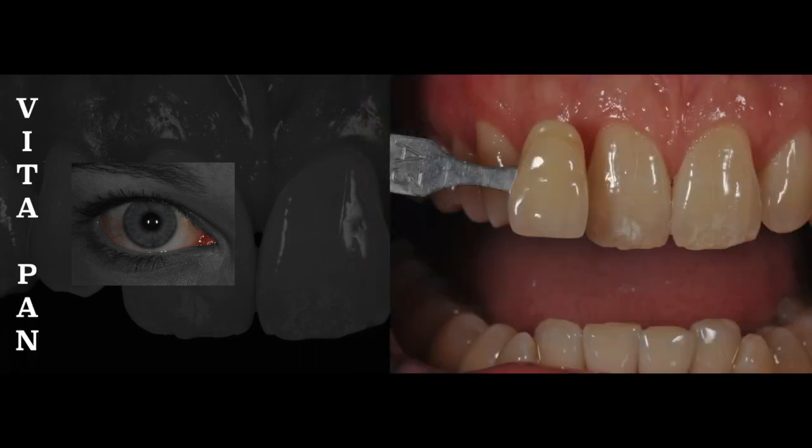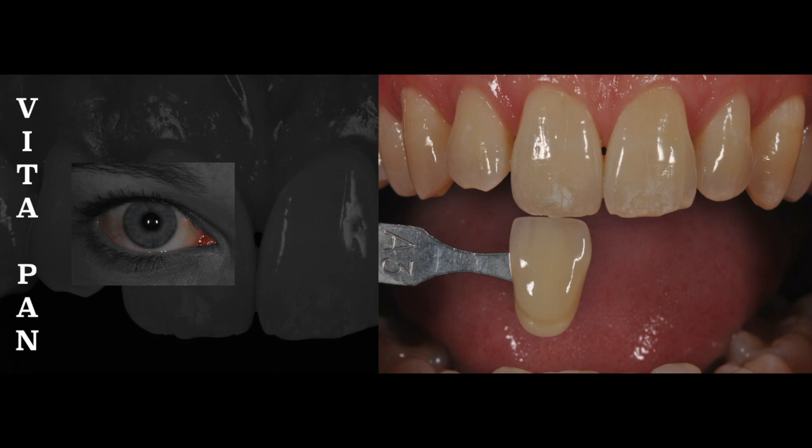If we position it in this orientation, look at the shadow that it creates on the distal surface of the tooth you are trying to match. This makes tooth number 8 appear darker than tooth number 9, making it difficult to shade match. If we position the shade tab in this orientation, now we are trying to compare the area of the shade tab that has the greatest translucency and effects, which can lead us to choose a darker shade than needed.